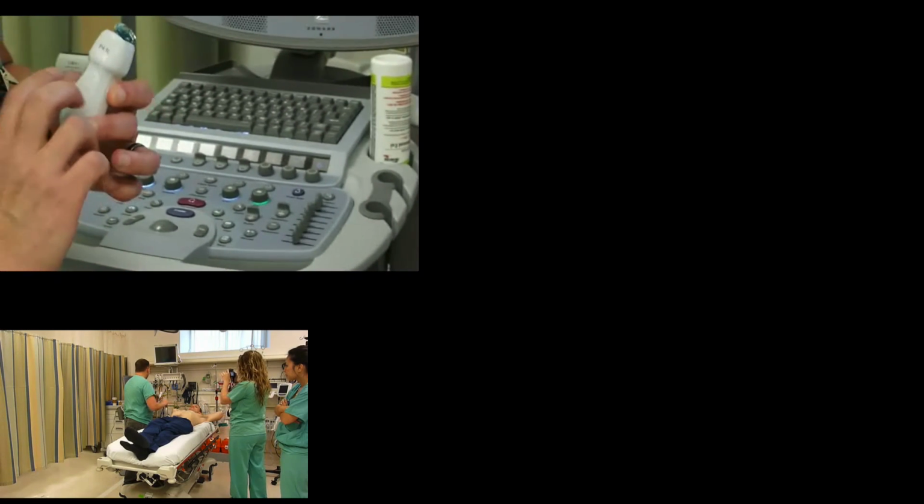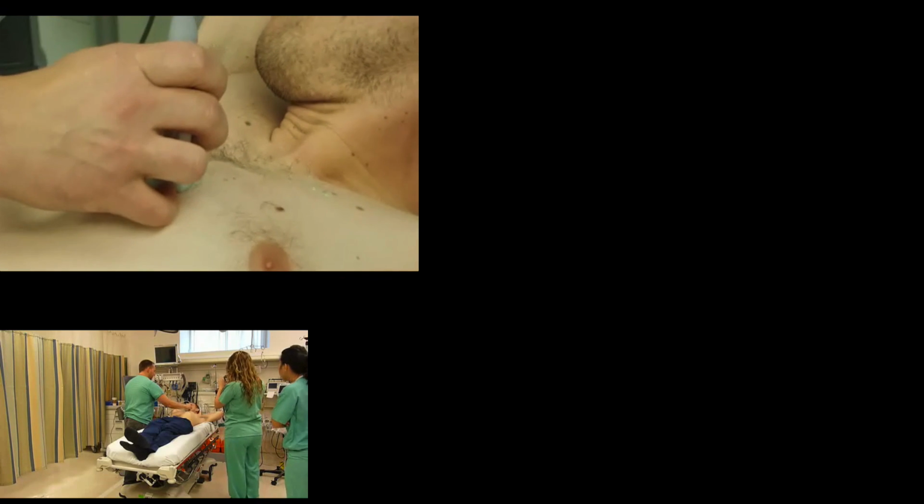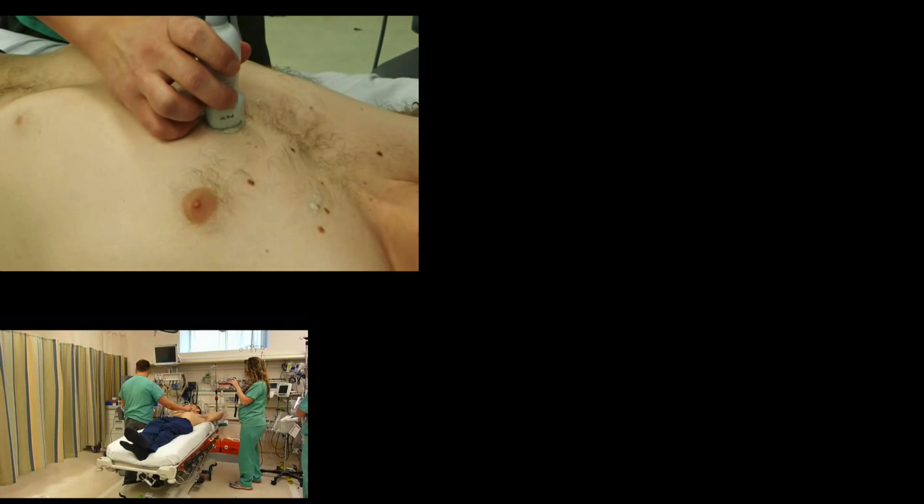You're going to choose your transducer, which is the cardiac transducer or the phased array probe. Choose your exam type, which is the cardiac exam type. Use some ultrasound gel, and we're going to start with the parasternal long axis.